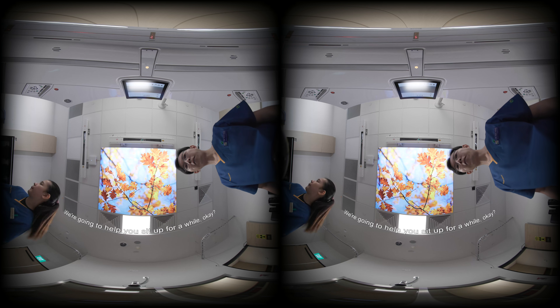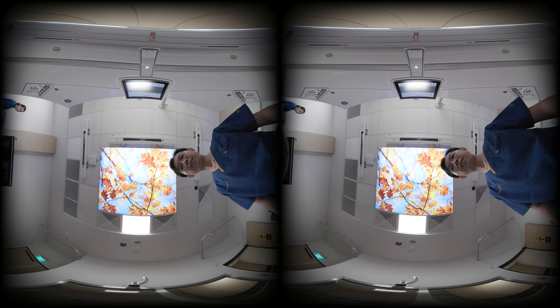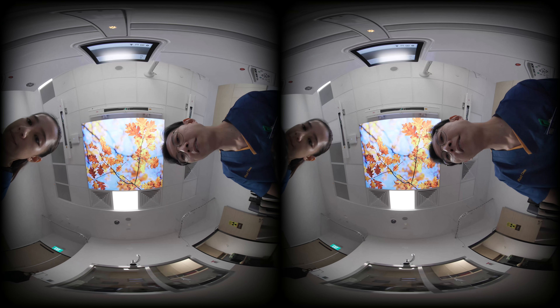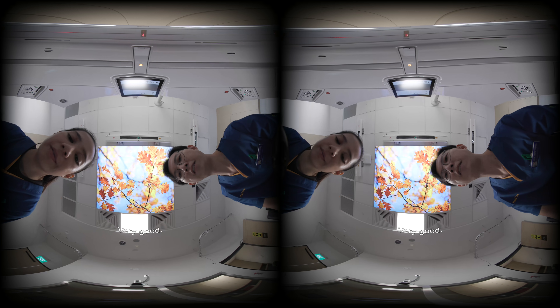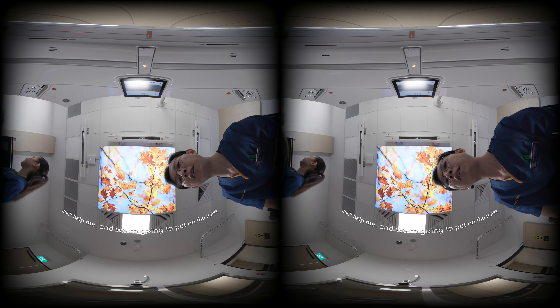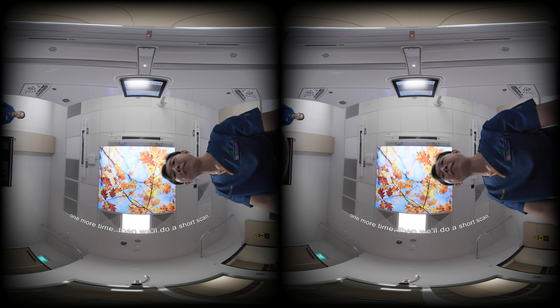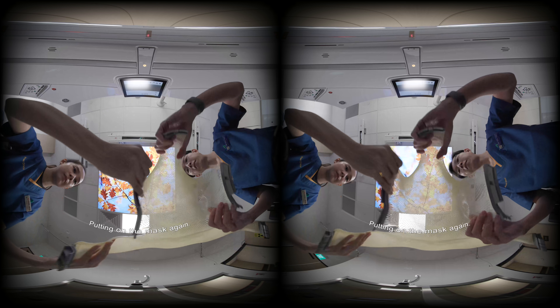I'm going to help you sit up for a while, just to check the fitting. Just lie still, let us help you up. Put your head back down again slowly. Very good. Just doing some adjustments. Don't help me. We're going to put on the mask one more time, then we'll do a short scan. Putting on the mask again. It's going to feel a bit tight, alright? It's normal for you to feel tight. Don't worry, breathe normally.